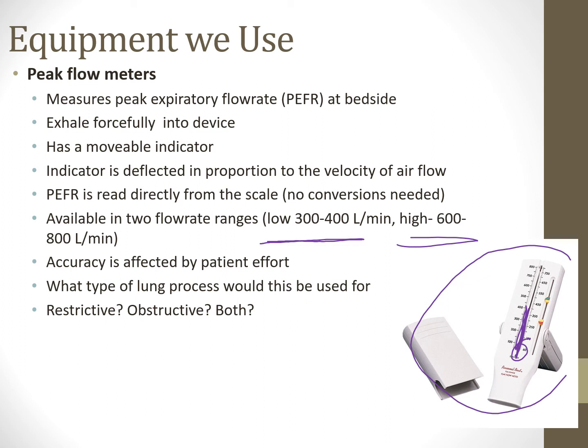Accuracy can be affected by patient effort. That's a big downside here, and that's one of the reasons why PFTs take such good coaching. You need to be a good coach. Get as much effort as you can out of that patient. You can't just say, okay, take a deep breath, blow as hard as you can, right? You're not going to be Eeyore. You are going to be Tigger. You are going to be a bouncy tiger, getting as much energy out of this patient to give you the best test.